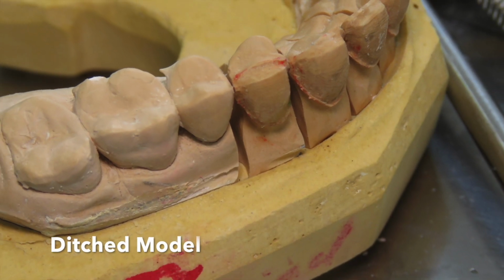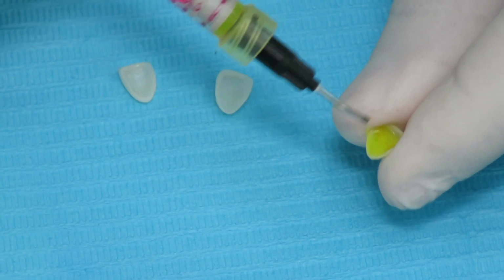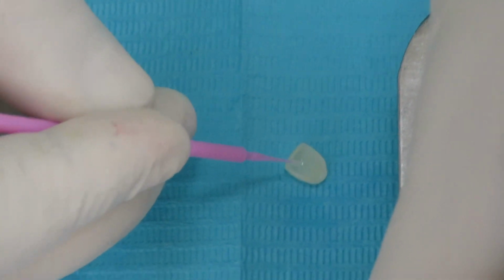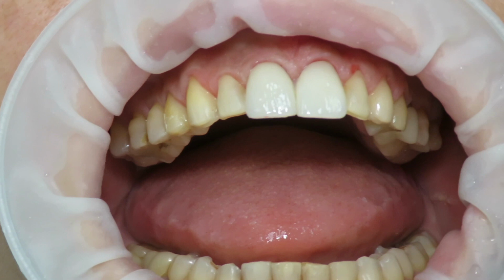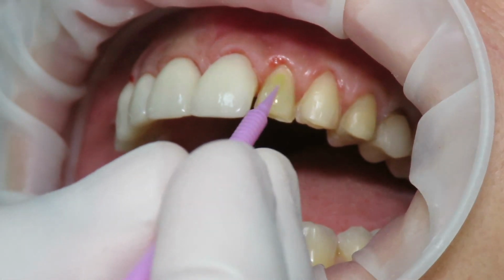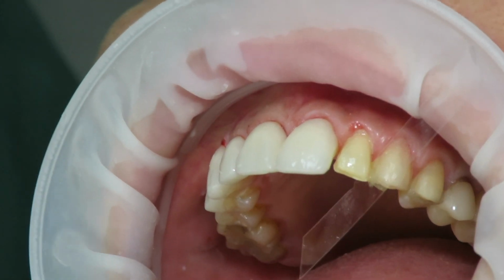So regarding the cementation of the veneers, we know the steps: preparation of the inner fitting surface of the veneer with HF acid for 20 seconds, then some silane for 1 minute, then, of course, application of the bonding. We use here a universal bond, and, of course, light curing for 20 seconds.